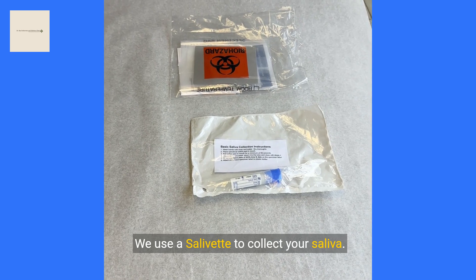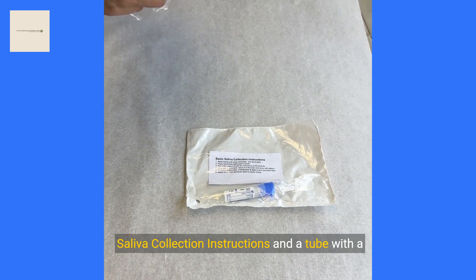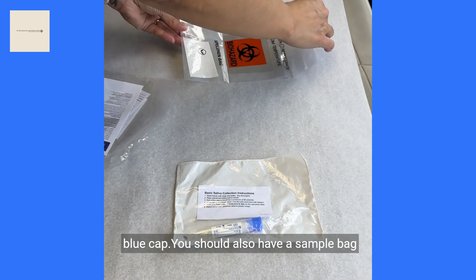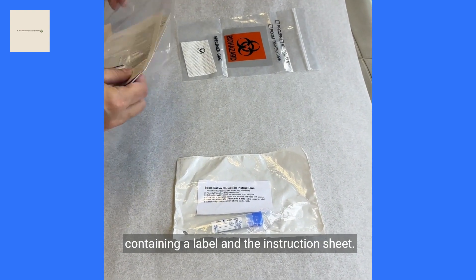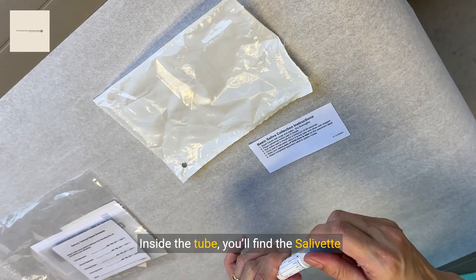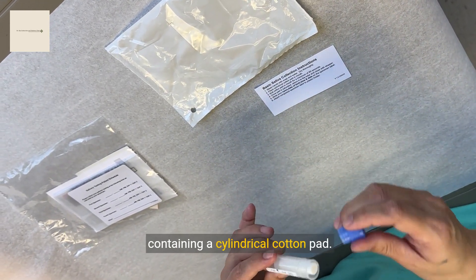We use a salivette to collect your saliva. It comes in a small plastic bag which includes basic saliva collection instructions and a tube with a blue cap. You should also have a sample bag containing a label and the instruction sheet. Inside the tube, you'll find the salivette containing a cylindrical cotton pad.